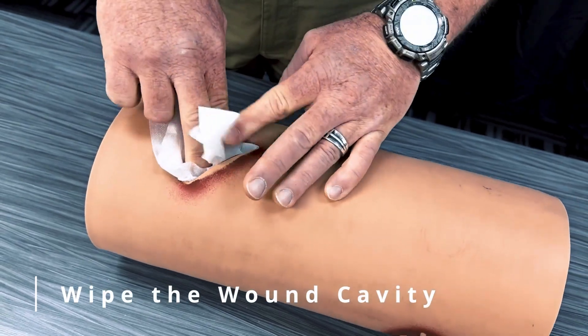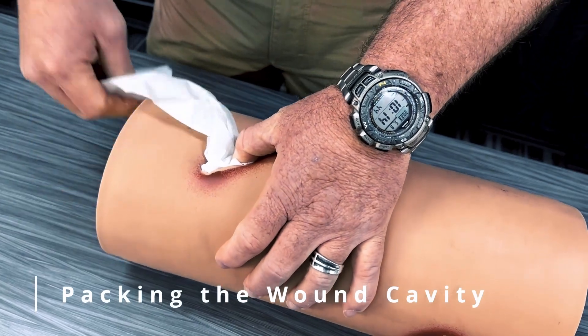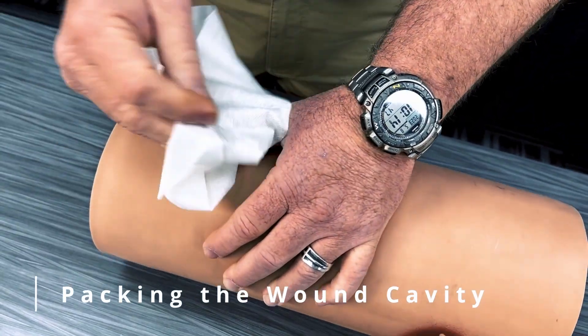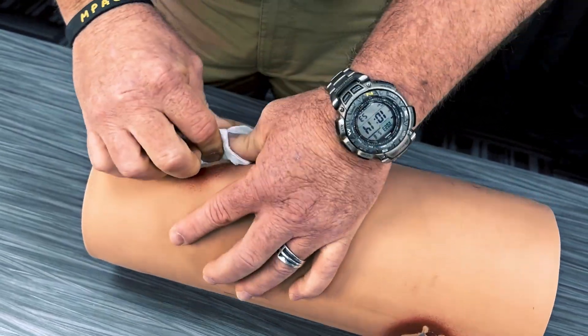Use 4x4s to wipe the remainder of the wound cavity to ensure there are no other sources of bleeding. Once the hemorrhage is controlled, pack the remainder of the quick clot combat gauze into the wound cavity. If space in the cavity remains, pack with 4x4s.